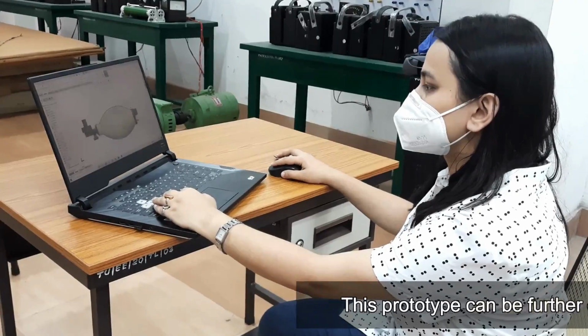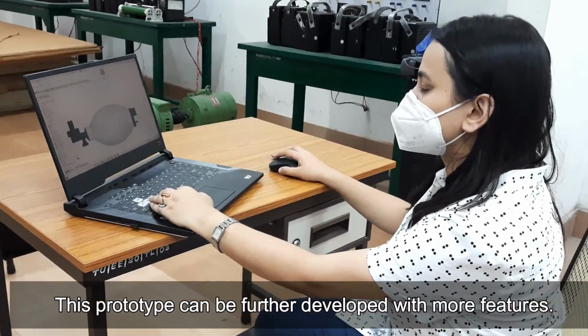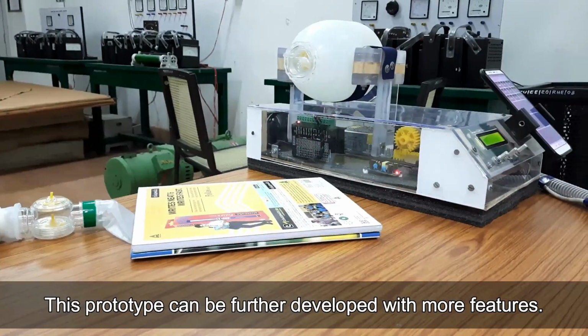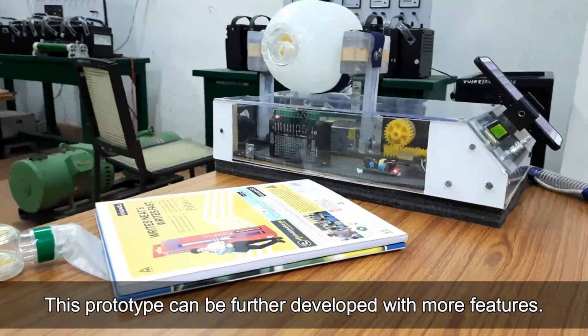This model will require testing for medical validation so that we can use it during emergency situations, but it cannot replace the medical grade ventilators.